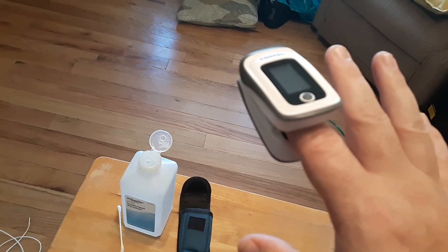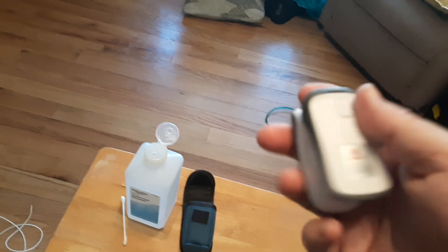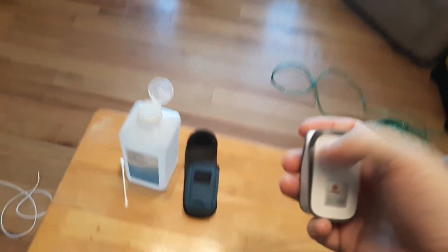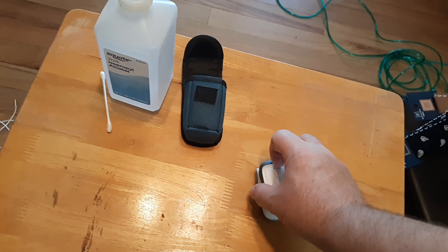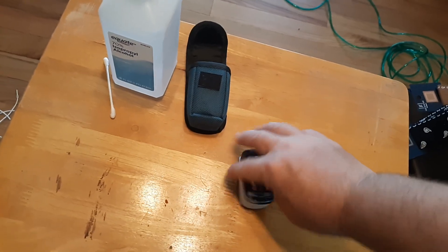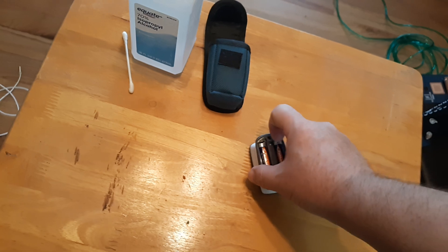There can be several reasons why it doesn't work but we'll go ahead and troubleshoot what they are and how to fix it. The majority of oximeters require batteries — usually they're going to be triple A batteries, that's the smaller ones like this. Some are chargeable but very rarely.